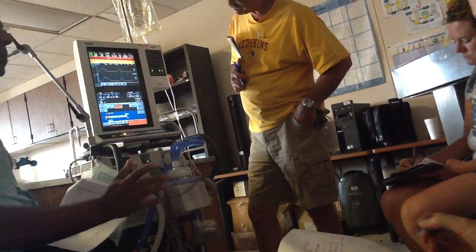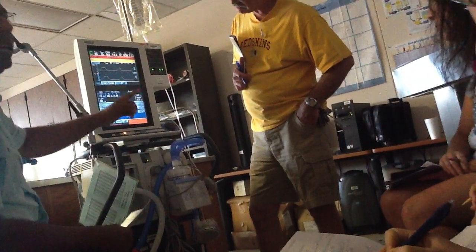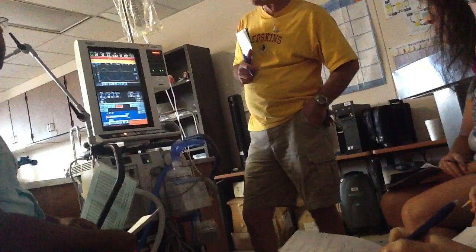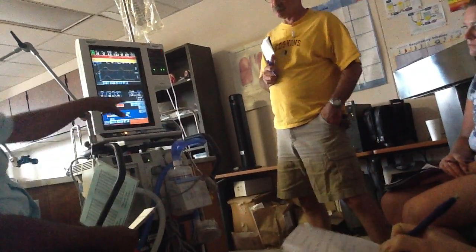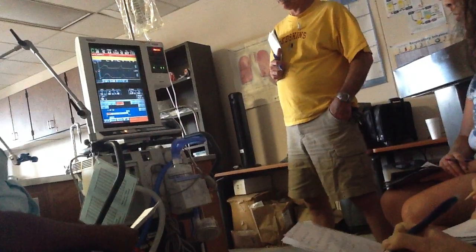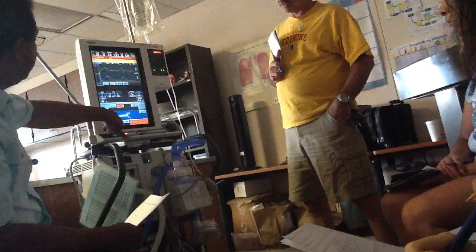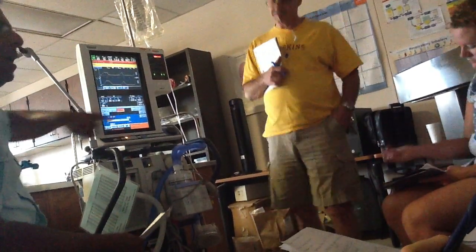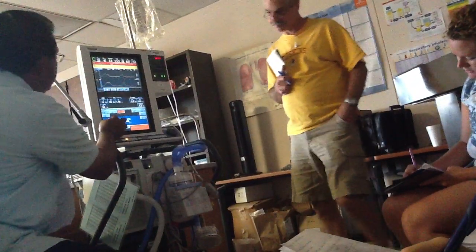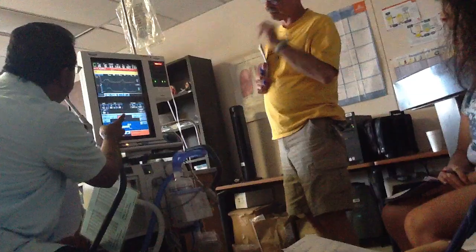This is very important, guys. You decrease that TI just like I was explaining to you before. In order to keep that IE ratio 1 to 4, what did you have to do to the TI? You had to decrease it. Are you gonna lock it? And you can lock it. See this button right here? Lock, unlock. Actually, this is locked already.